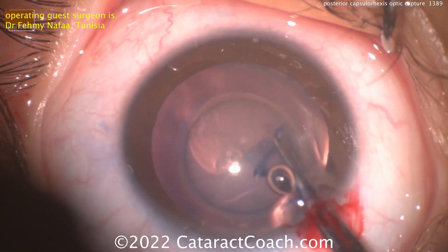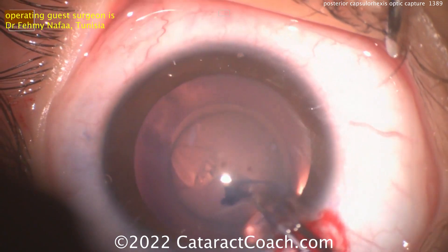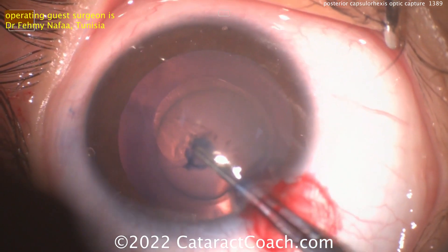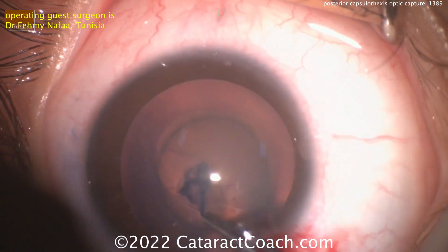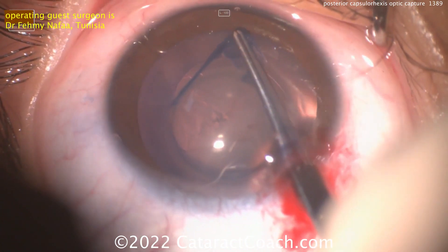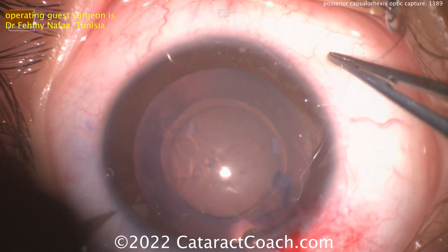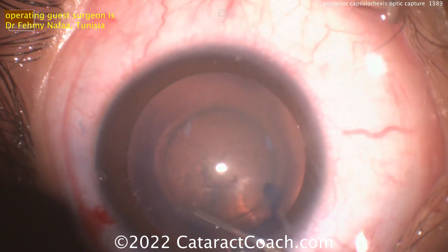Howard Gimbal from Canada really helped us out a lot. He published a paper that explained all different types of sulcus fixation and optic capture. The one we know about most is fixation where you put the haptics in the sulcus and the optic goes behind the anterior capsule rim. But there are other options as well.